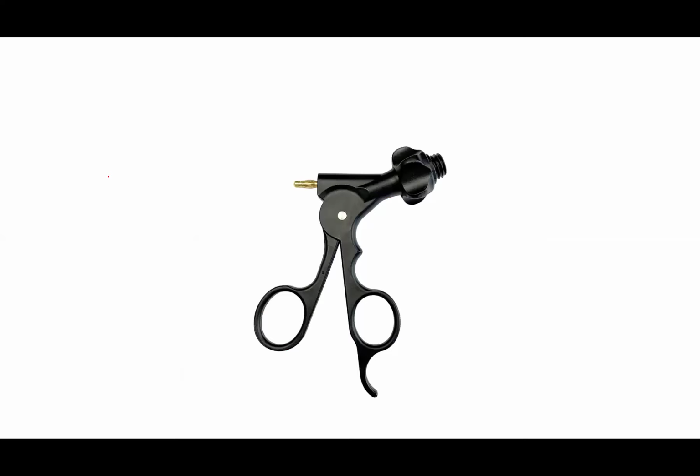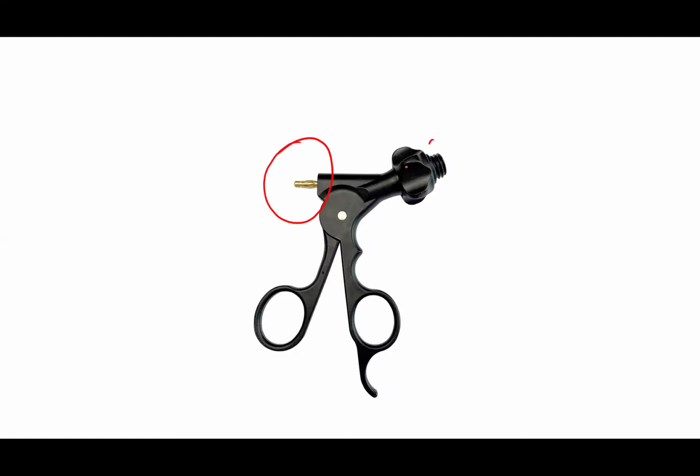Now you can see this handle is a handle without a ratchet. Usually these handles without a ratchet are commonly used for instruments like scissors or Maryland for dissection. Because if you are cutting, you don't want a ratcheted handle. You can't be cutting and it's locking and you are unlocking while cutting. Or during dissection, you want it smooth. And they either have an energy point or not, for attaching a cord to an energy device or a diathermy. Now, this is the shaft of the instrument, and you can see this portion is screwed into the rotation knob here, so that it is fixed.